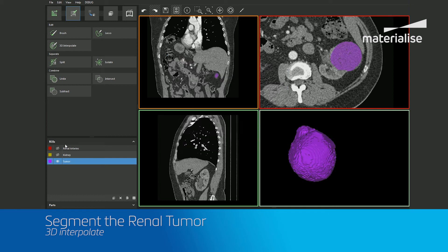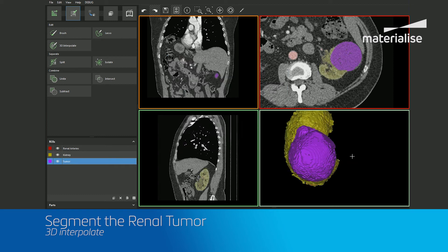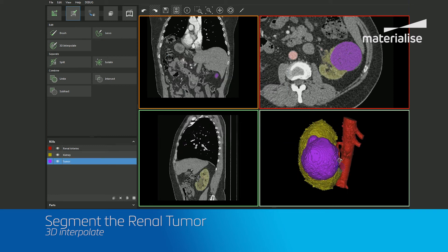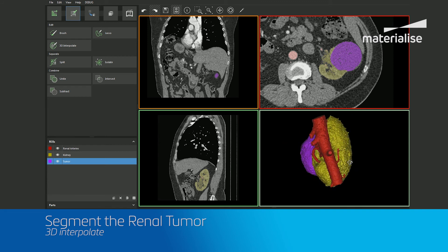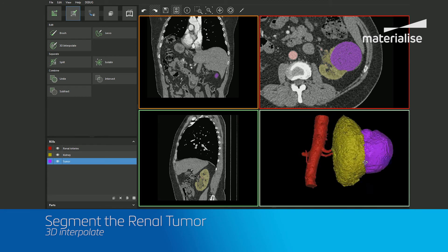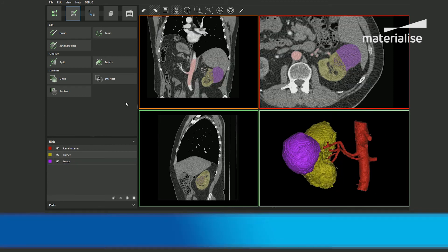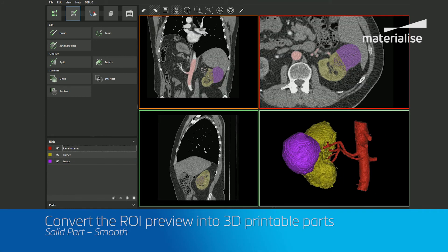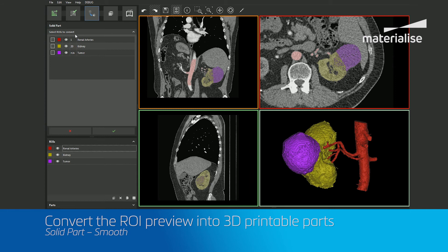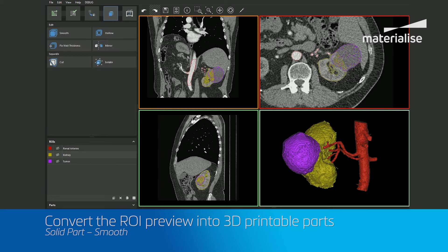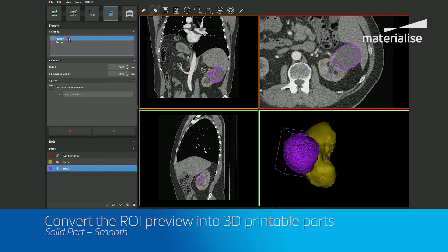Once satisfied, click on the green checkmark and rename and recolor your segmentation as needed. With that complete, we can now visualize all the regions of interest together. And with the segmentation process complete, we'll move on to the next step, which is to convert the segmentation into a 3D printable part.